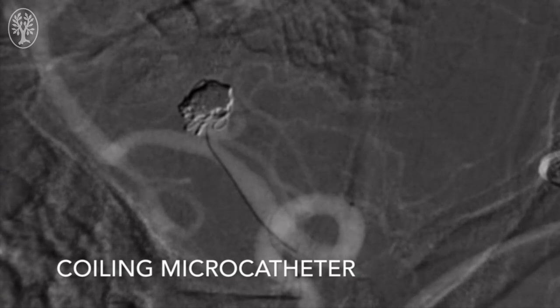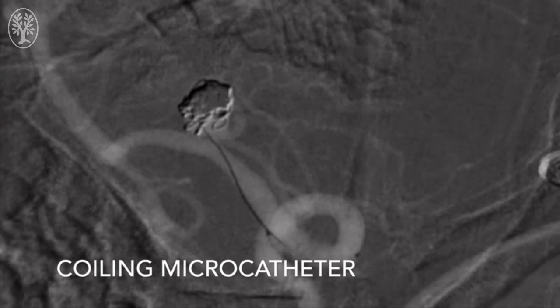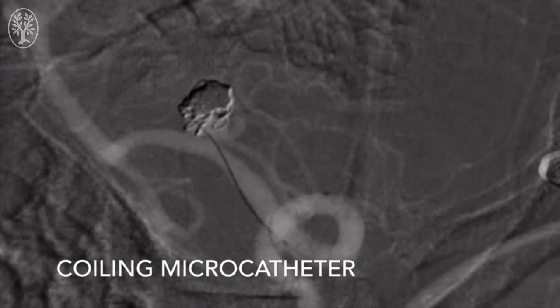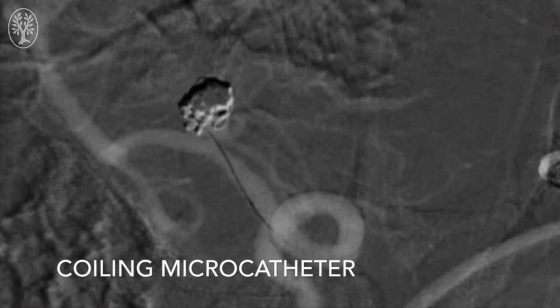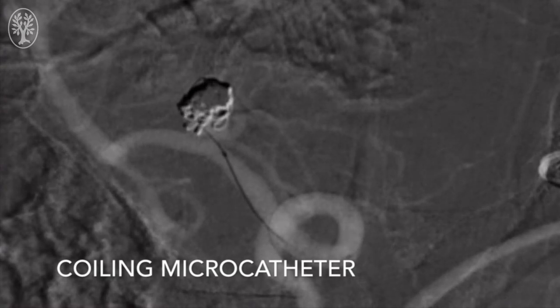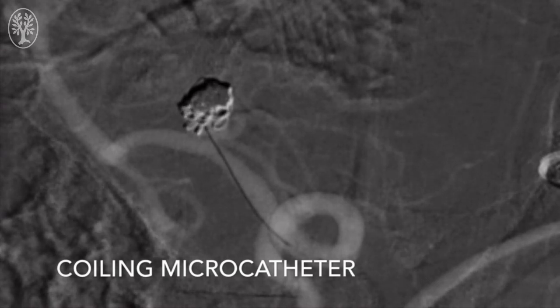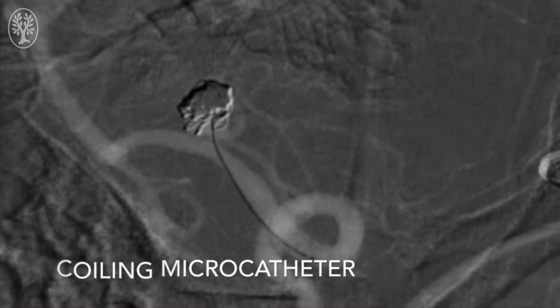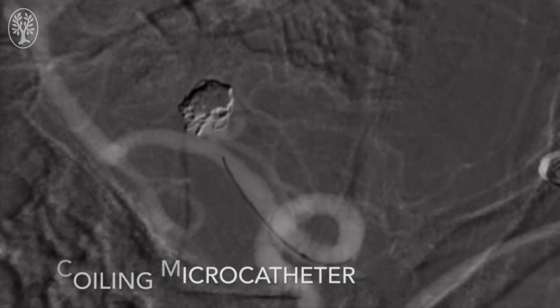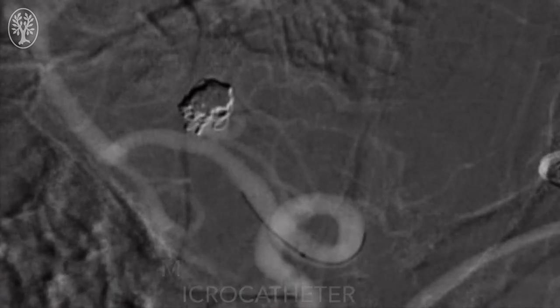Once we bring the microcatheter into the aneurysm, we're going to withdraw the microwire and prepare for coiling. Here we can see that we're bringing the microcatheter into the aneurysm along our microwire. Ideally, we would like to get deep purchase into the aneurysm in order to help the new coils insinuate themselves into the old coil mass. This is ideal to prevent coil herniation of the newly delivered coils.